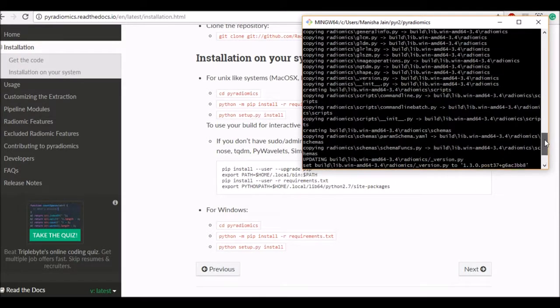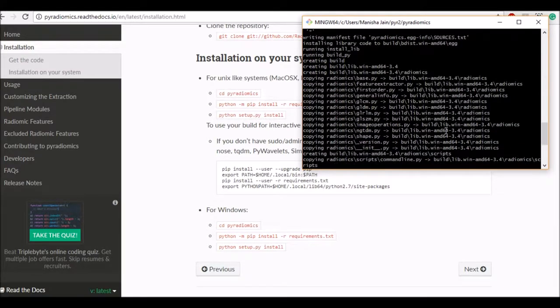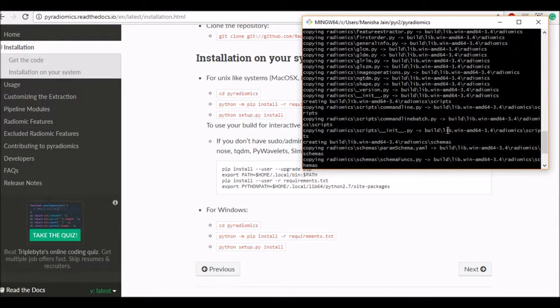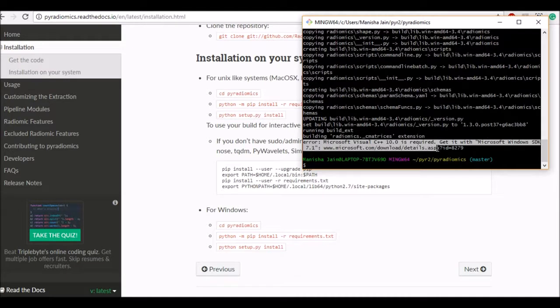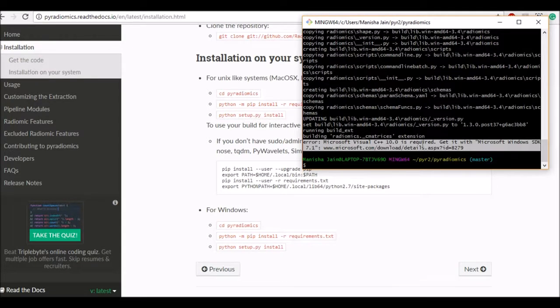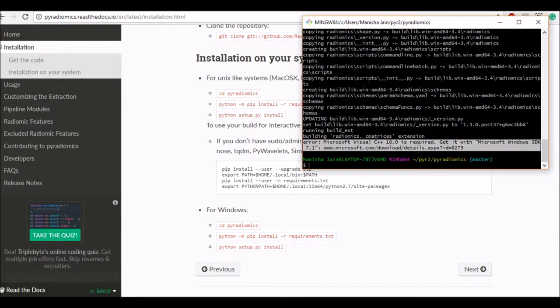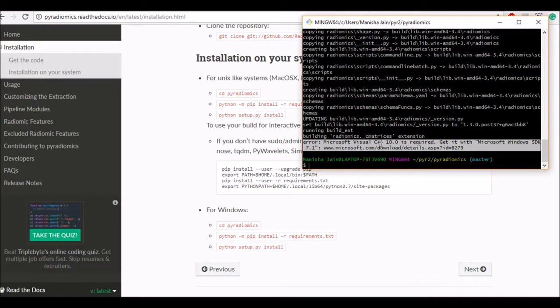So this finished and it has copied all the files which were needed for pyradiomics and it started to compile and at the end of the day it threw an error which is a very weird error. Microsoft Visual C++ 10.0 is required and they recommend to get the SDK version from this website. So I've spent quite a bit of time on this website trying various options and none of them worked. So I have tried Visual Studio all versions of them Visual Studio 2012, 2013, 2017 but none of them could fix the problem.